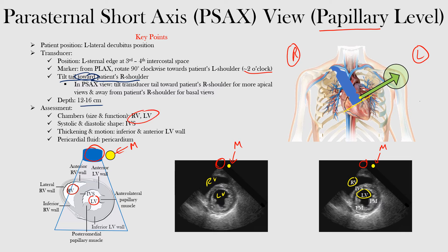We can also assess the systolic and diastolic shape of the intraventricular septum, which is this portion here. Notice that between the right ventricle and the left ventricle, you have the IVS or intraventricular septum. We're at the papillary muscle level, so we can see two papillary muscles: the anterolateral papillary muscle, which is this one here, and then we have the posteromedial papillary muscle, this other one.